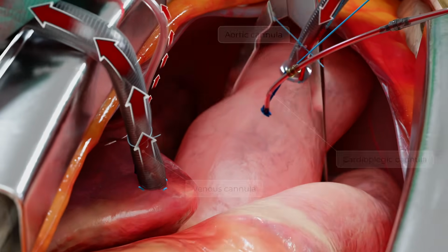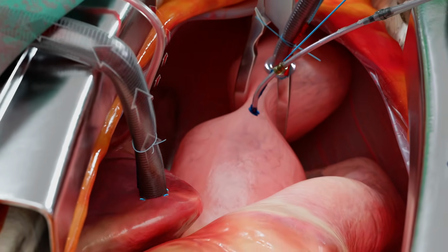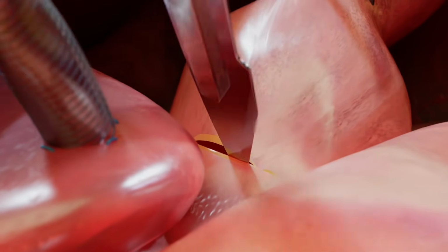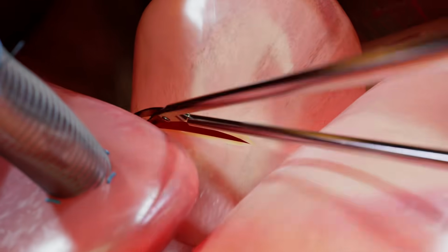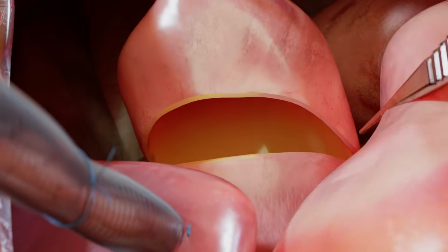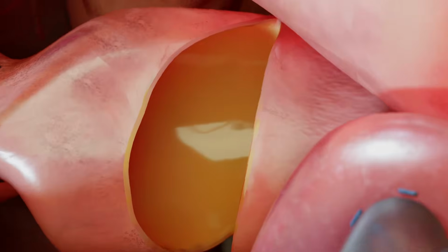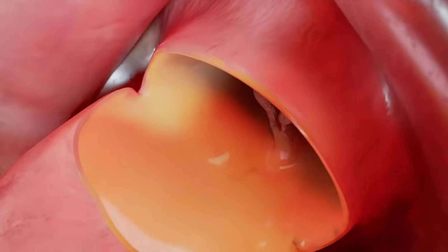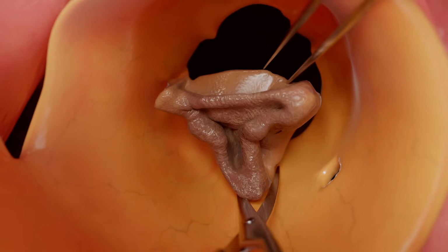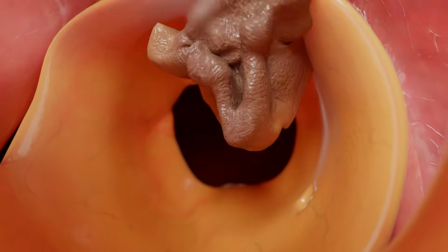After cross-clamping the ascending aorta, a specialized cardioplegic solution is administered to induce controlled cardiac arrest. With the ascending aorta opened, the surgeon visualizes and excises the affected valve. During this step, the valve is removed and the aortic root is carefully cleaned from tissue fragments and calcium deposits to prevent debris from entering the left ventricle or coronary ostia.